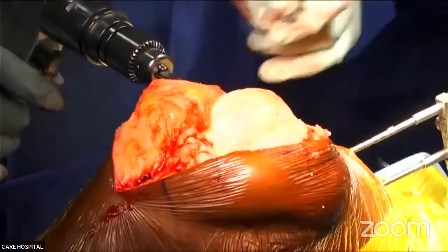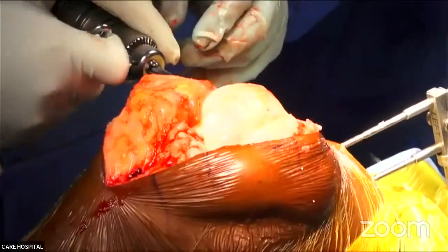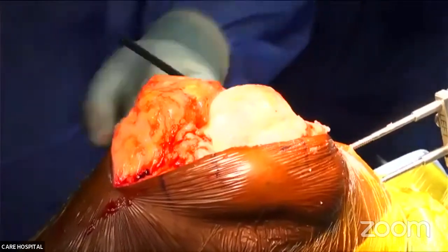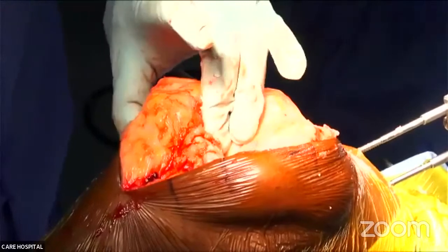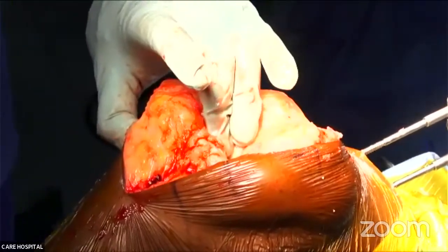Okay. So medial side will balance it. So this is a pin to retract the patella so that it doesn't come in the way of the burr.